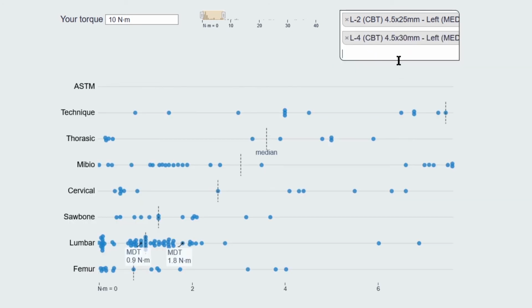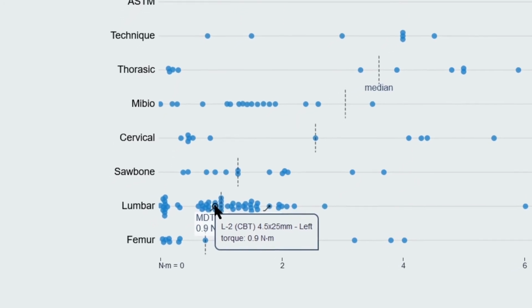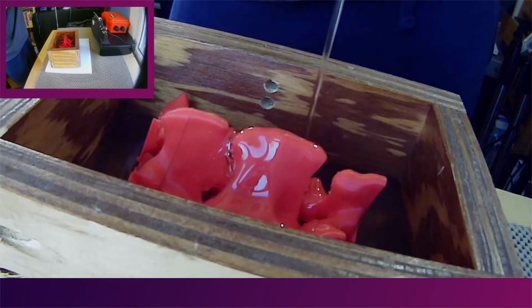And then we take a look at the 2 ranges. These are the values we're going to use for training. Finally, we prepare the print.